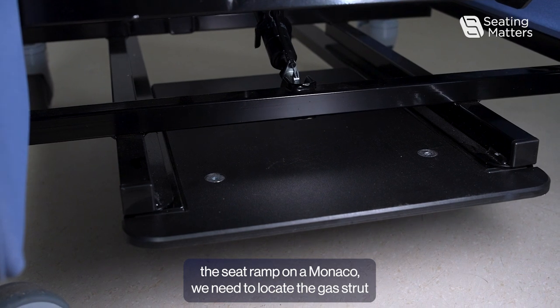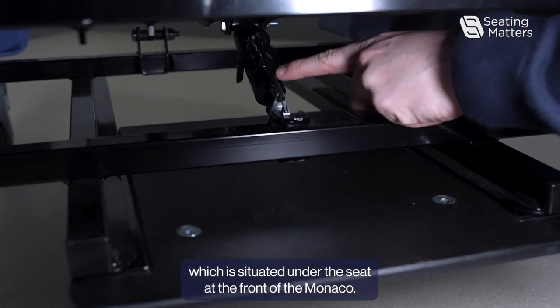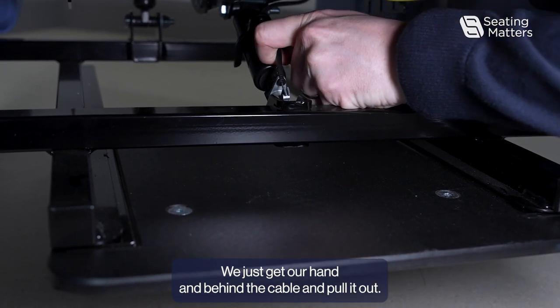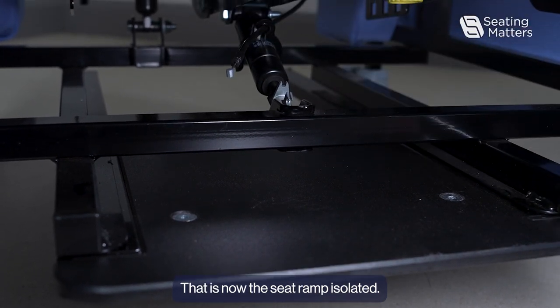To isolate the seat ramp on a Monaco, we need to locate the gas strut which is situated under the seat at the front of the Monaco. It's the same process — we just get our hand in behind the cable and pull it out. That is now the seat ramp isolated.